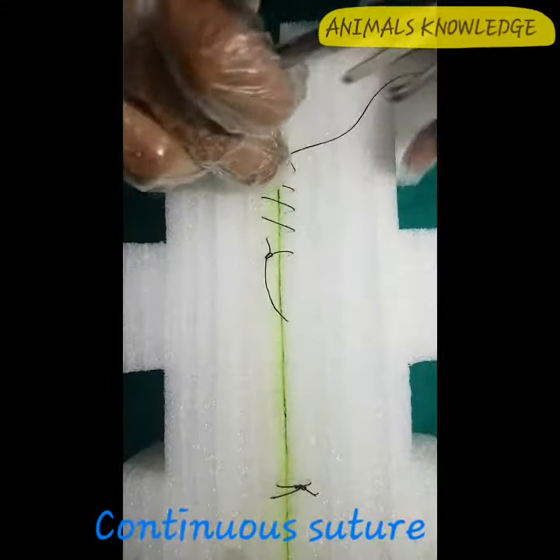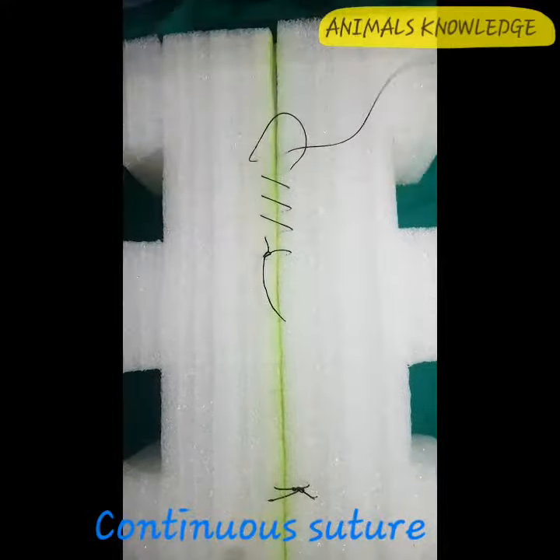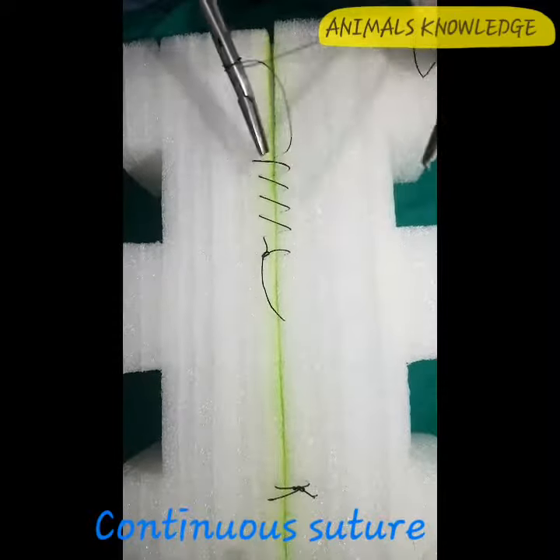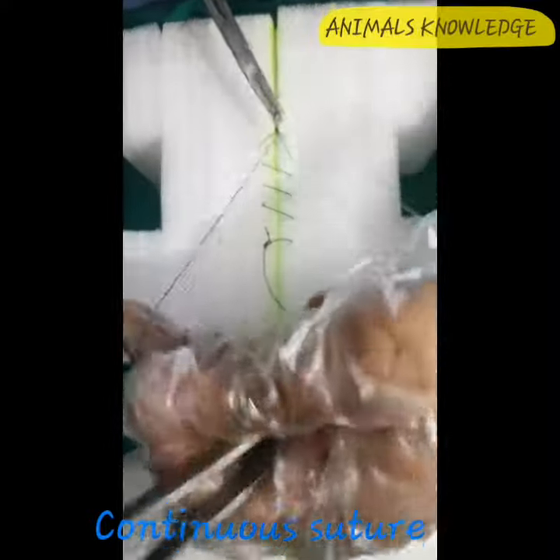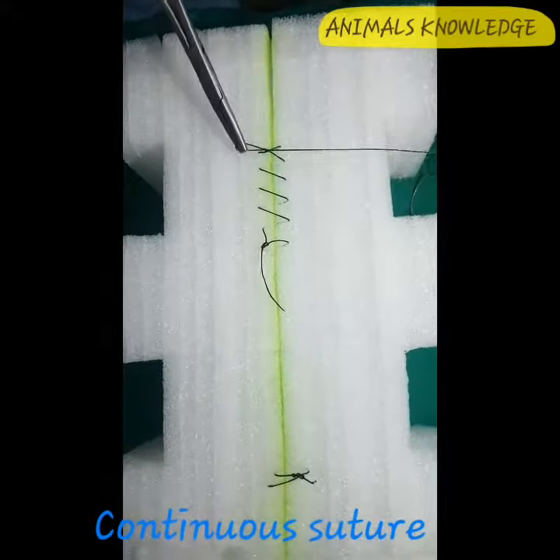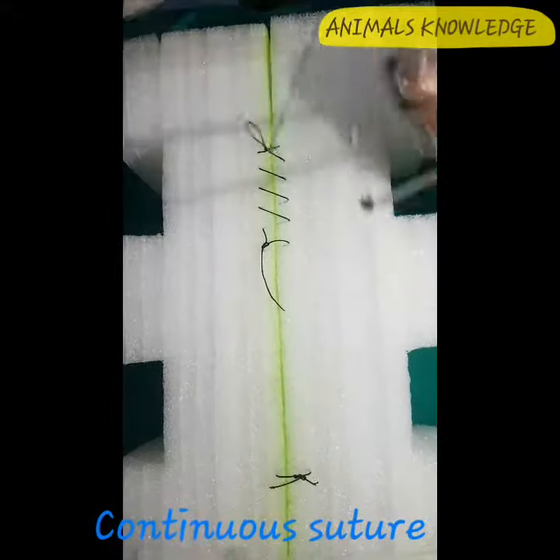To close the suture, tie a surgeon knot. Loosen the previous suture, make two clockwise loops and tie a knot, and then finally make a single anti-clockwise knot and tie the knot.